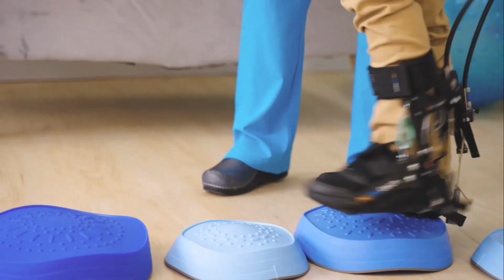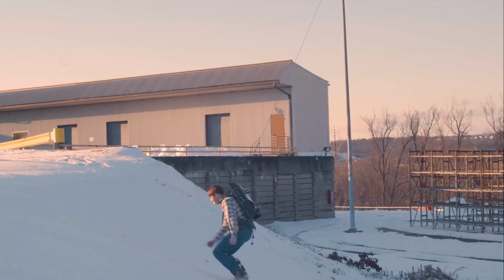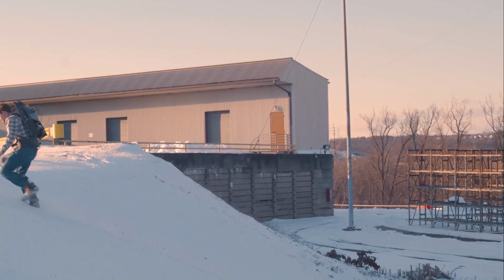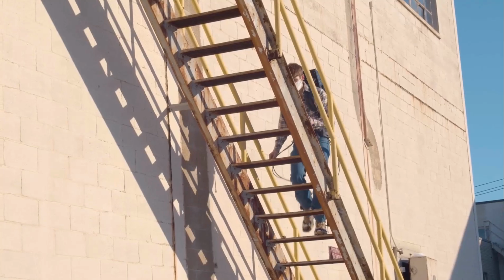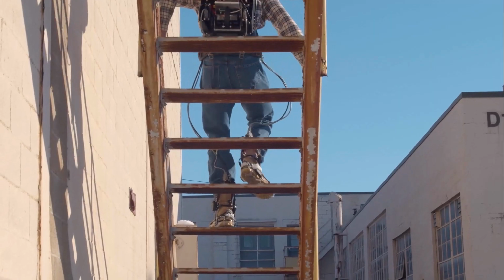Real-time control is crucial because of the human safety aspects, as is performance because human biomechanics requires high loads and fast motion. Controllers must be both stable and intuitive to use. The robotic system must be helpful when assistance is needed and transparent when it's not.